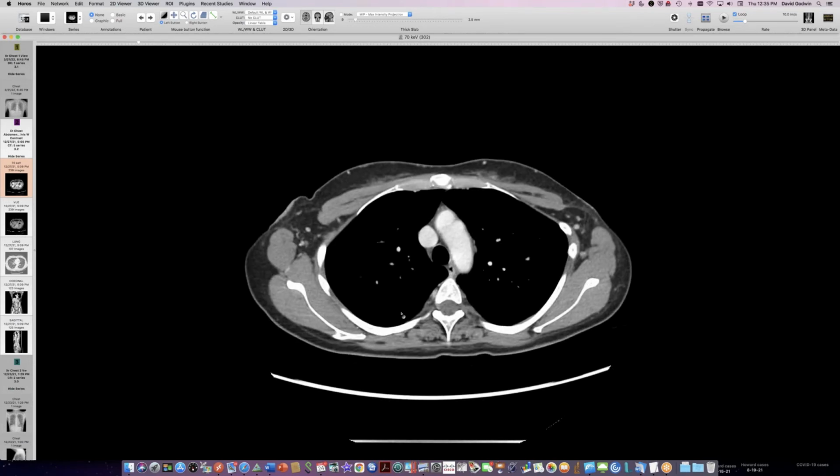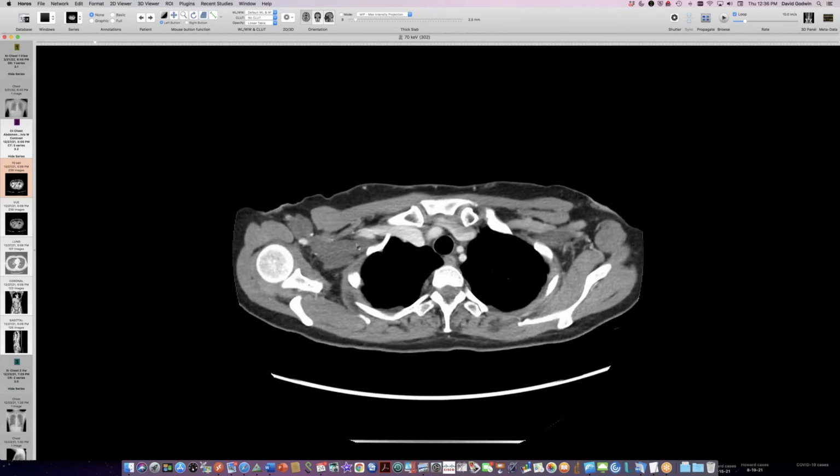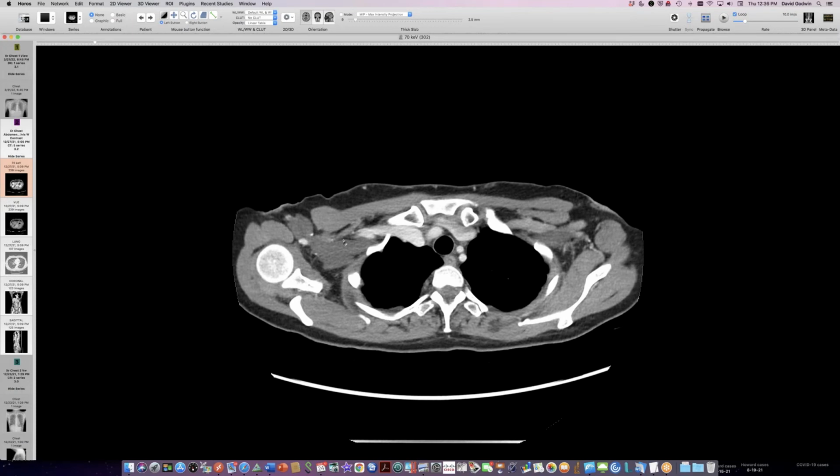So this is an inflammatory condition. They've treated with things like rituximab, and in our case, this person's going to have a stem cell transplant. When it was first detected on a cervical spine CT, our neuroradiologist thought that it was neurofibromatosis, but evidently the low attenuation, the fatty degeneration of the nerve, is part of this condition. So I think the low attenuation is probably a clue to this. This is different from what I think you see with neurofibromatosis. I don't think that has the same low attenuation.